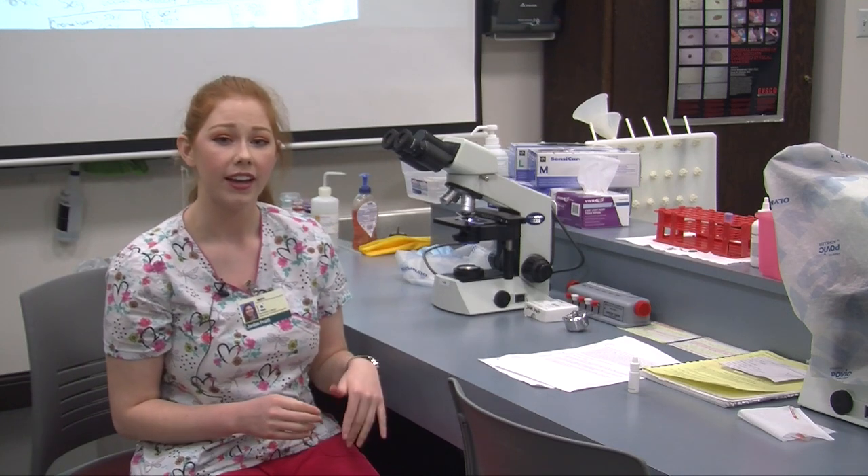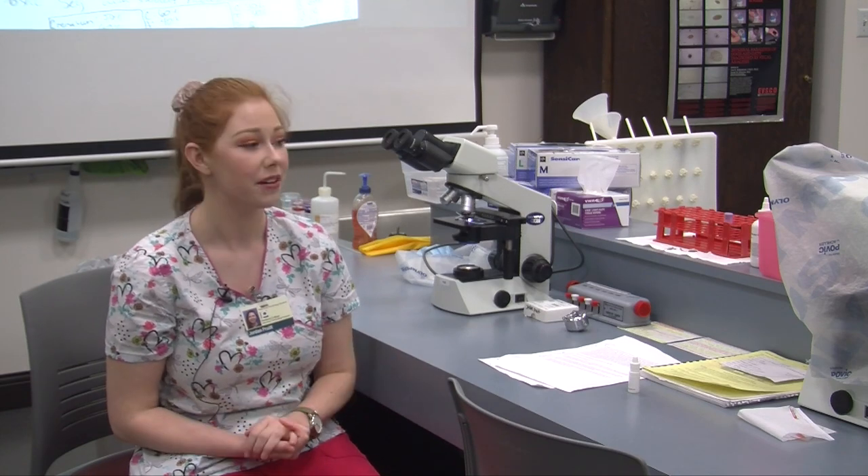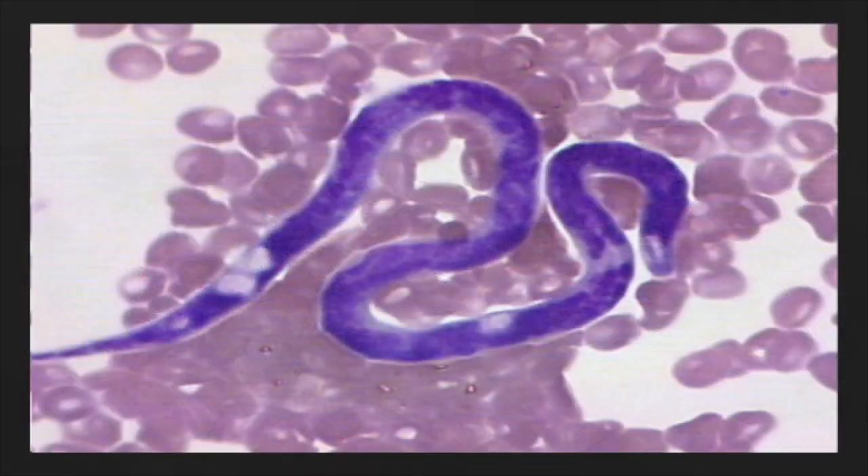Before I go, I would like to show you one more thing, and my peer here, Terry Arnold, will be talking to you about that next part of the video. So this is a picture of the Microfilaria. Jordan told you about how she looks for Microfilaria on the blood slide.